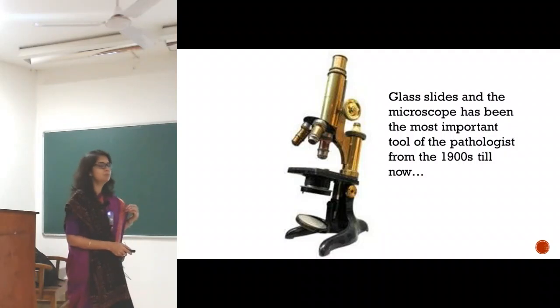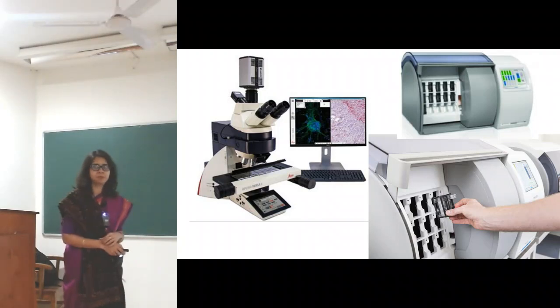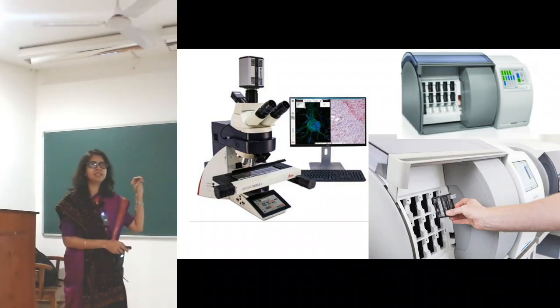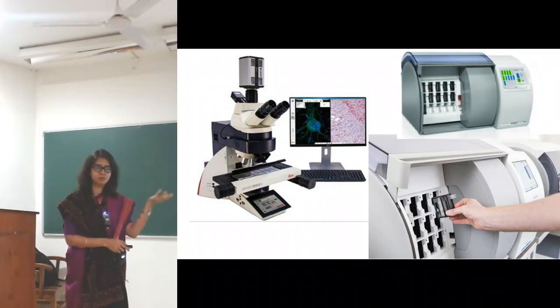So pathologists did most of their work on microscopes till the digital scanner came into the picture. So are you familiar with the scanner? Do you have some computation background, most of you? Yeah? So this is where he told you about how the lab works. When he sends a patient for a biopsy, that tissue is taken and processed and we make glass slides. We look at the cells through the glass slide and make a diagnosis.